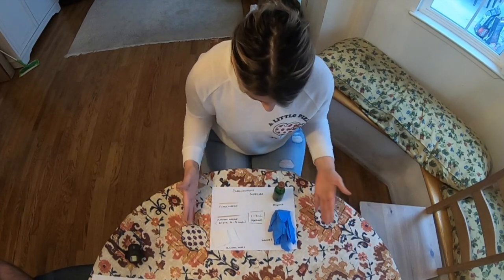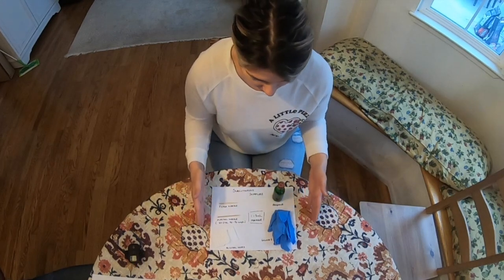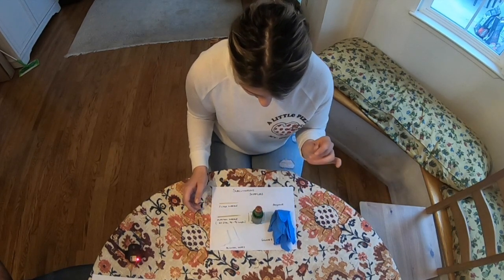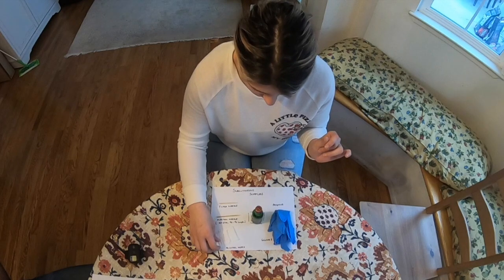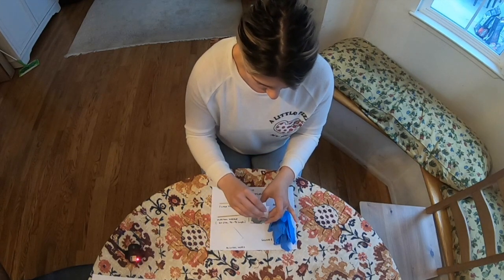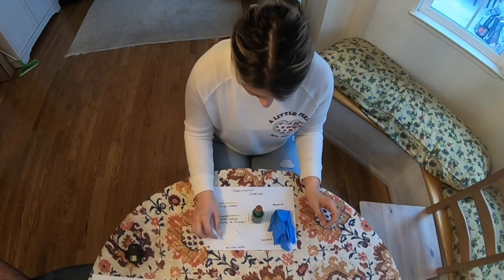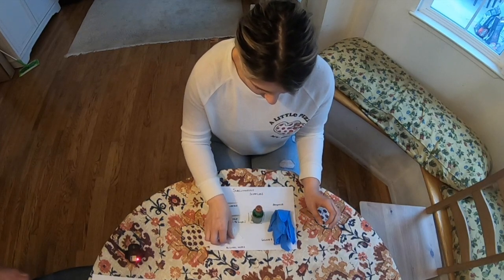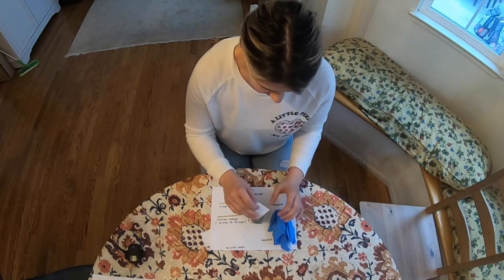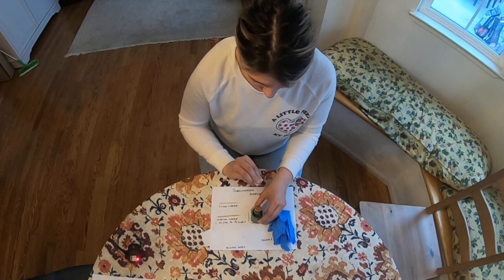To begin, you will set up everything in a nice clean space. You'll take your ampoule, take an alcohol wipe, cleanse the top of it, let it dry, have another alcohol pad, then take the top of the ampoule and break it away from you.